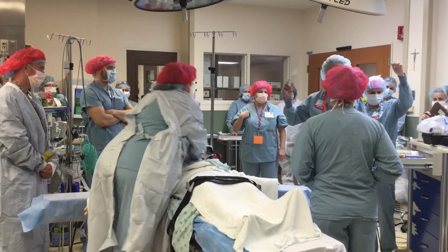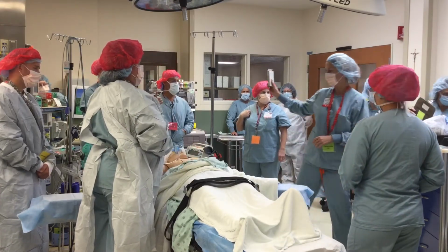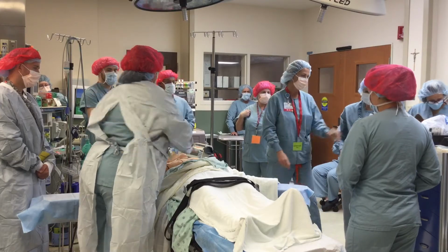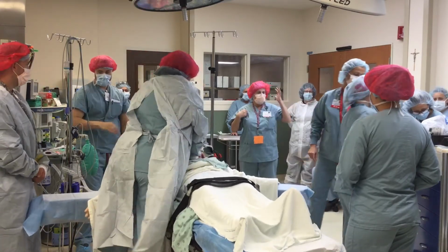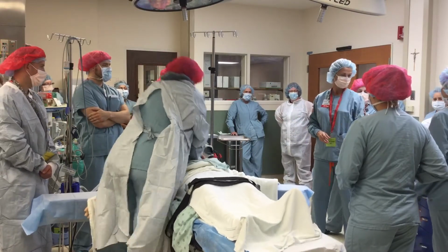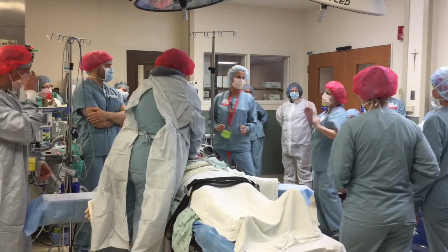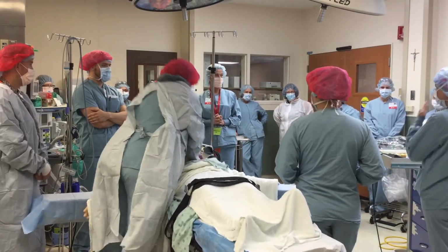Epi in. All clear. Shock. Continue CPR please. Epi in, first shock. Okay, so you're not touching meds. Your crash cart person's gonna give you the meds and you give them. Charge to 300 please.